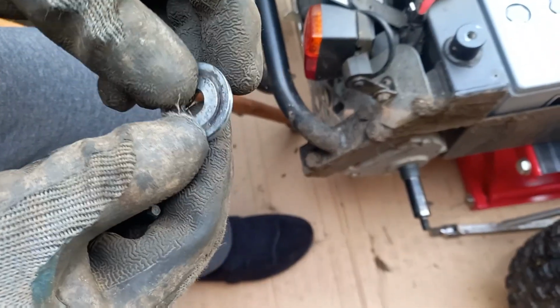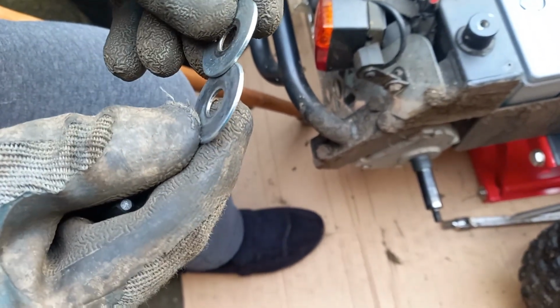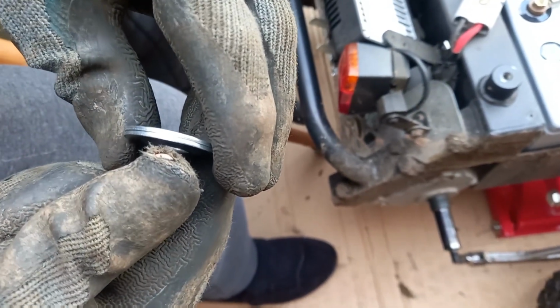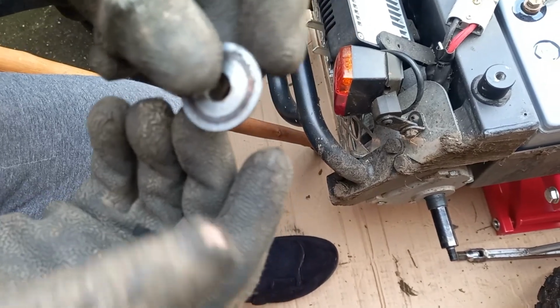The washers that hold the hub assembly on are very thin washers, and they've doubled up with them because they're so thin, and they've bent. So when they bend, it makes the nut loose, and then the whole thing starts to fret. What that really should have had is probably something slightly thicker than that, and a proper single thrust washer sort of thing that should have been on the outside of it, really.